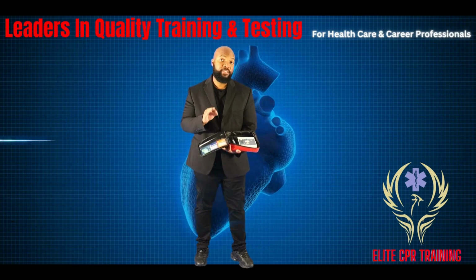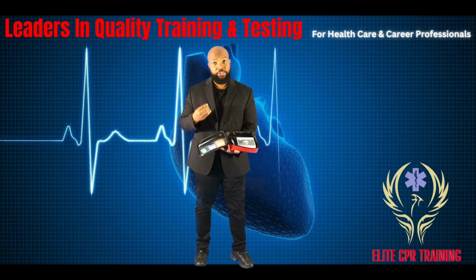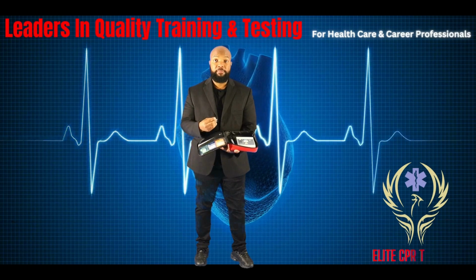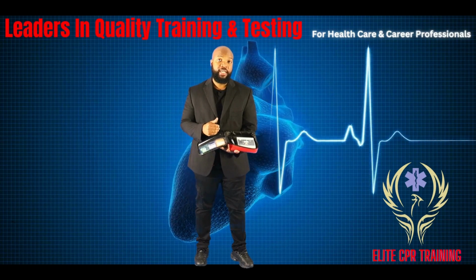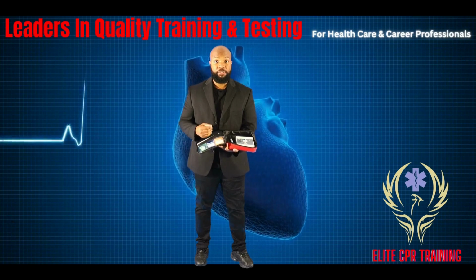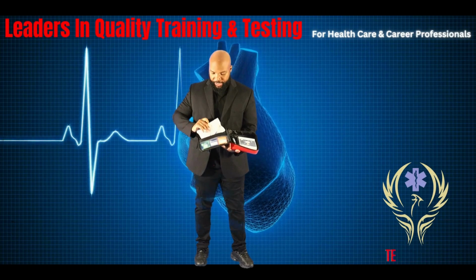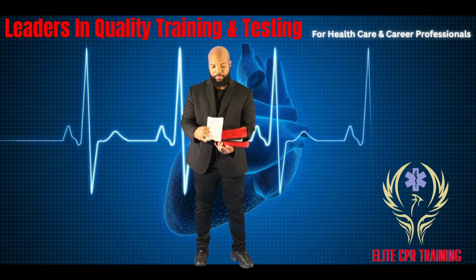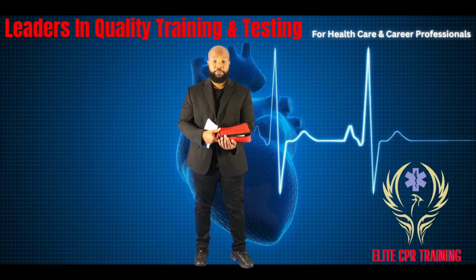Remember, if the pacemaker, that internal defibrillator, is not working, that means you need to use that AED. So even if the person happens to have a pacemaker or an internal defibrillator, remember it's malfunctioning, which is why they're in cardiac arrest. So yes, you absolutely would use the automated external defibrillator, the AED, but you'll put it below. As you can see, the pads have pictures, and with these pictures, it shows you exactly the direction on where to put on the AED.